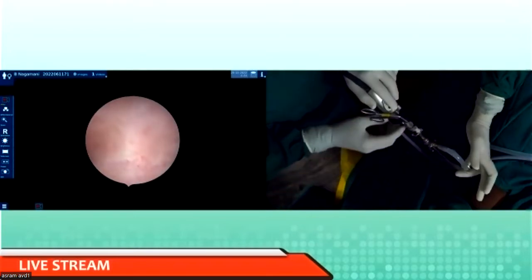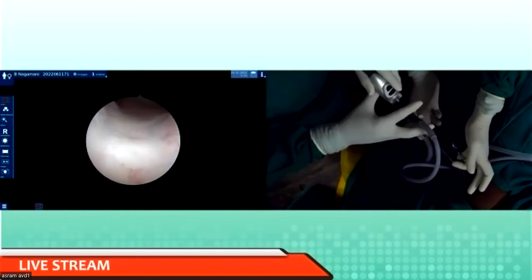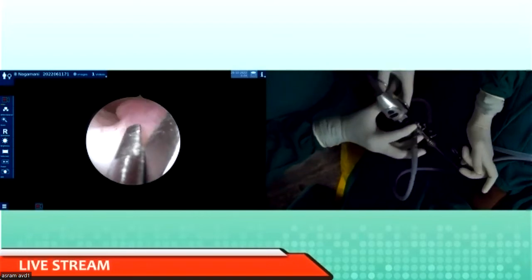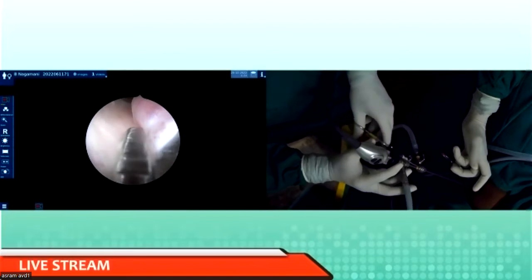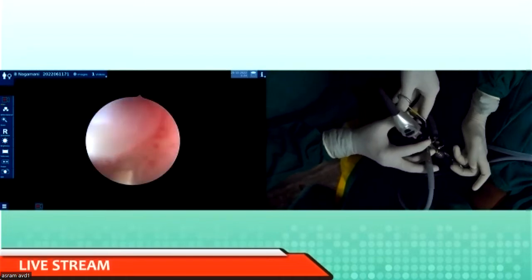Okay, sir. That is why you have to do your white balance properly. If you don't do your white balance properly, you will be in trouble. You'll be walking into the myometrium, entering the myometrial wall. Okay. And this is how you can cut the polyp.